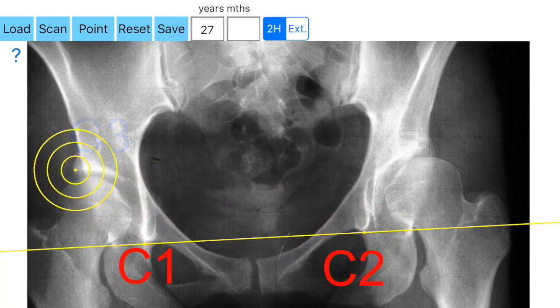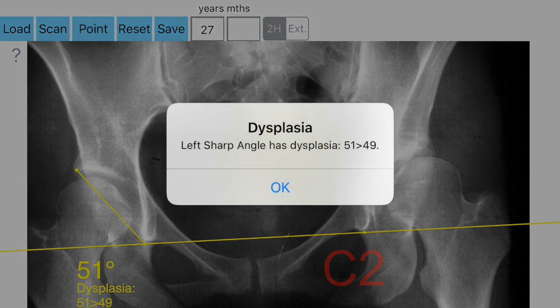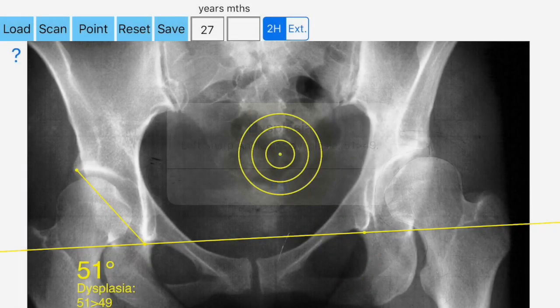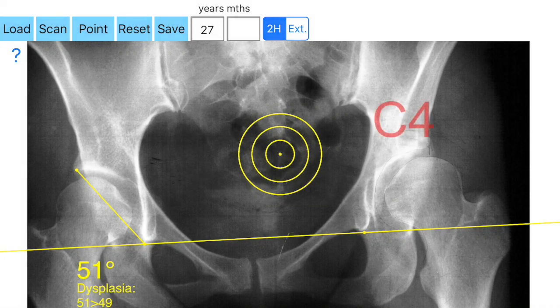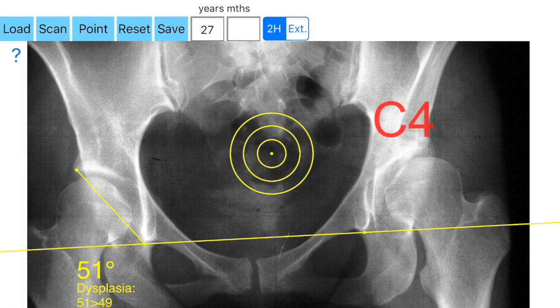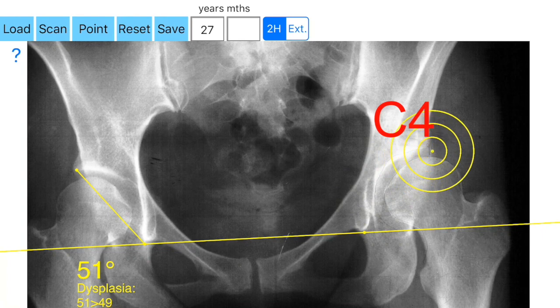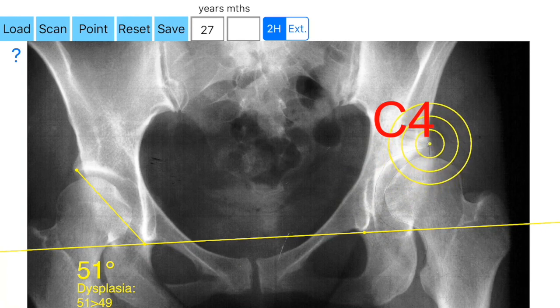The right AA angle over the right hip is measured and the values in degrees are printed on the screen, with the relevant categorization as normal, borderline dysplastic, or severe dysplastic over the right hip. Similarly, the left lateral acetabular border, C4 left, is marked on the image by the transparent circular template.